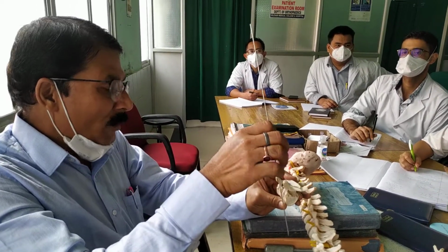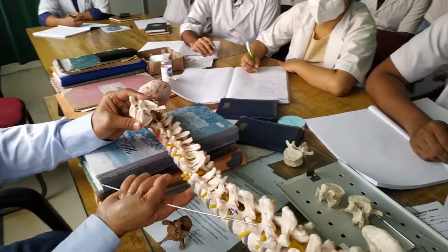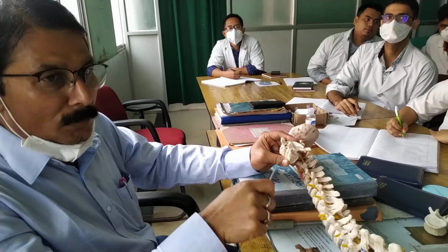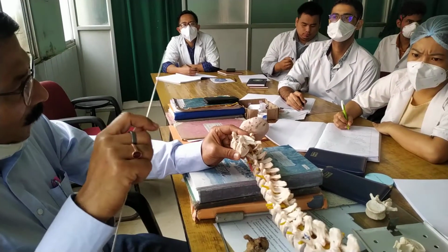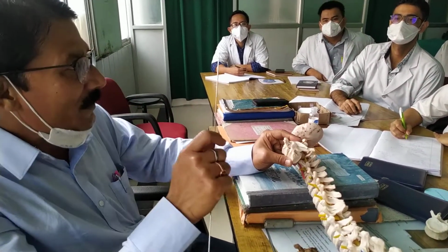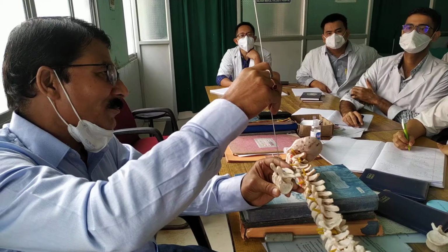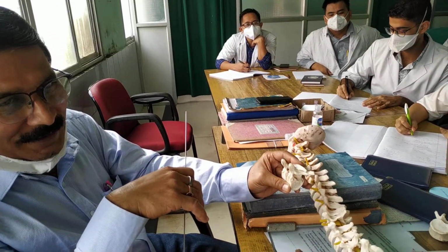Okay, sir? So it may change depending on your direction. If the vertebra is lifted up, if you are more kyphotic, then the direction will be a bit different. But while it is flat, the direction will be a bit different. Why will this lordotic difference be there? But grossly, anatomically it is directing caudally. So your direction will always be caudal. How much caudal should be determined by the image from the lateral side.